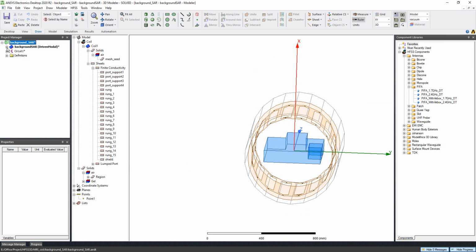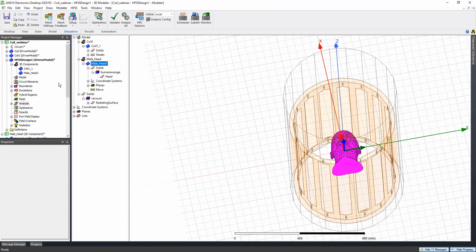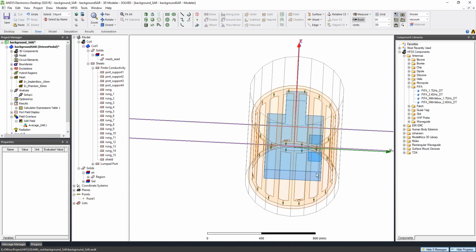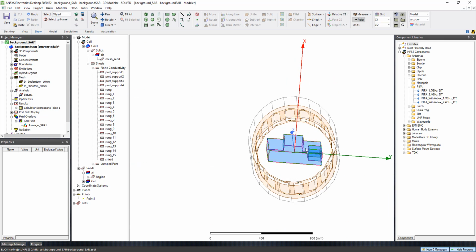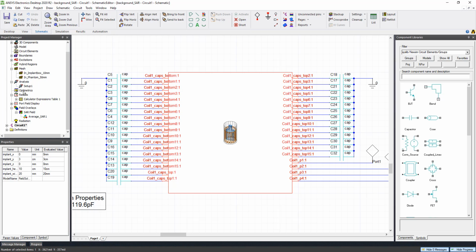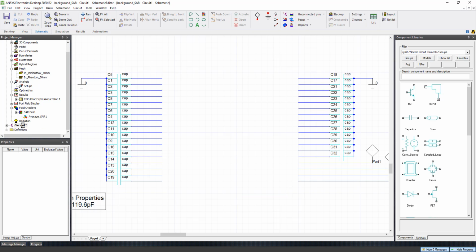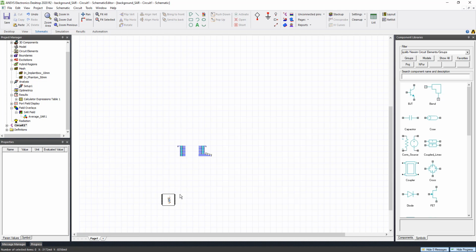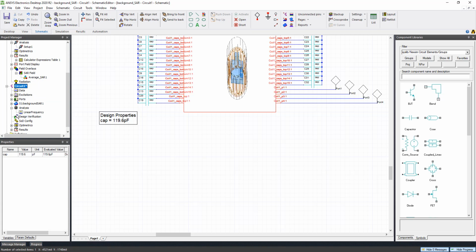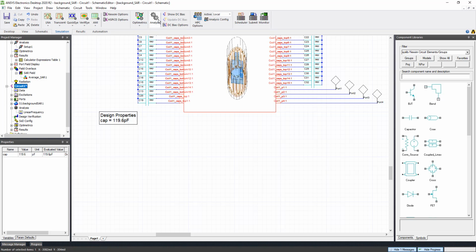One more thing to mention is when you create the 3D components for the MRI coil, the circuit is not included. So when you have the human head or the gel inside the coil, what you need to do is delete the center part, then copy and paste over, and then just hook it up again. Where it goes, right? So you just hook it up again. Then you should just run it, right? Everything should be the same. And then just run it, analyze.